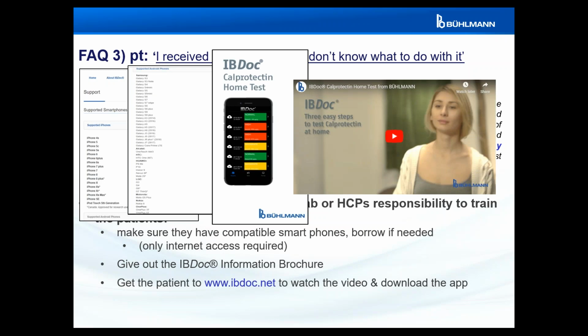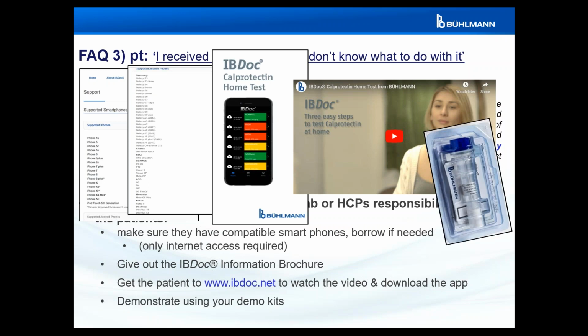I think all of you have watched the video. On the IBDoc website, we try to get people there as much as possible, patients, clinical users and administrators. Every time we train, I always walk through that video, and I think it's a good resource. We are updating this video, and we'll have a new version of it next year, just so you know. And then also, please demonstrate using your demo kits. Every time we send out a starter kit, we also send demo kits out.